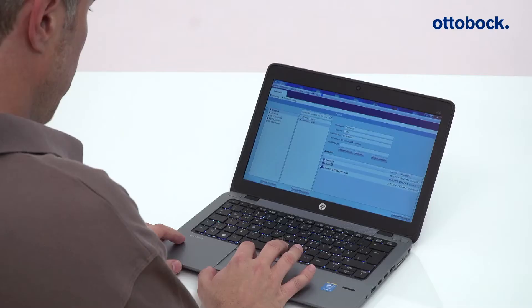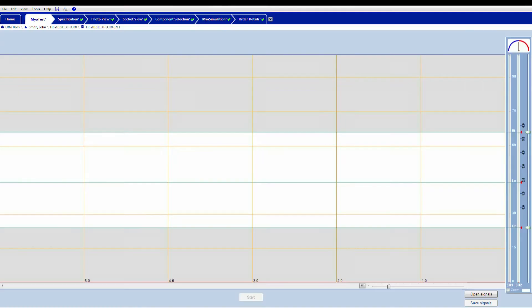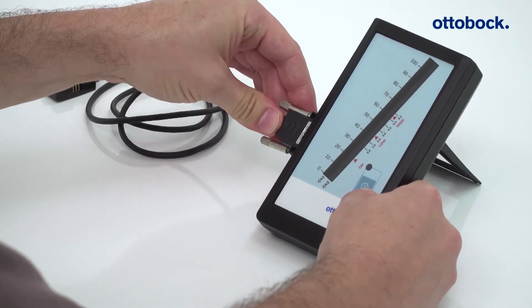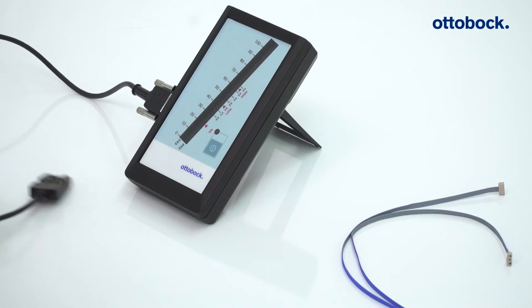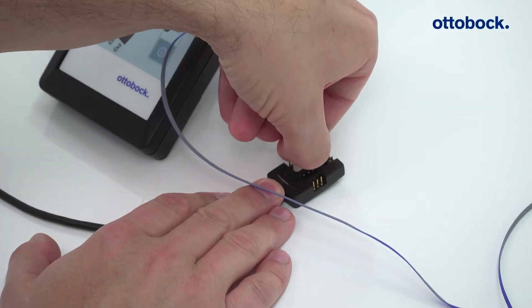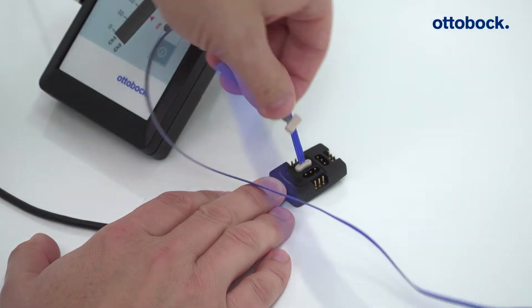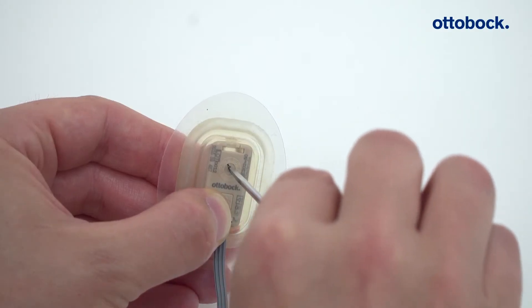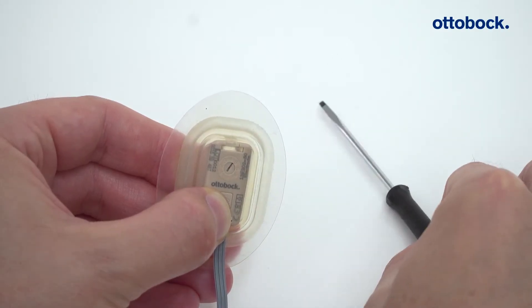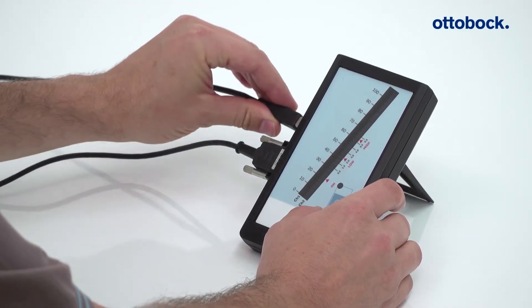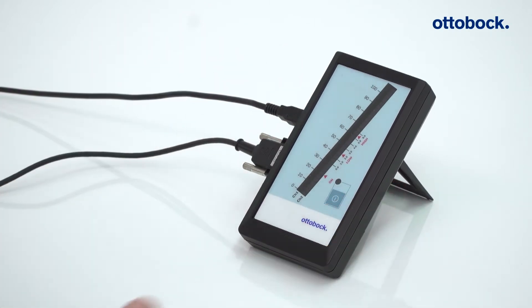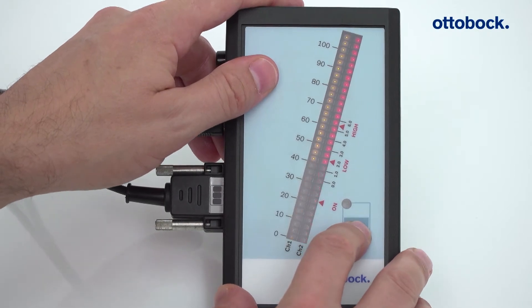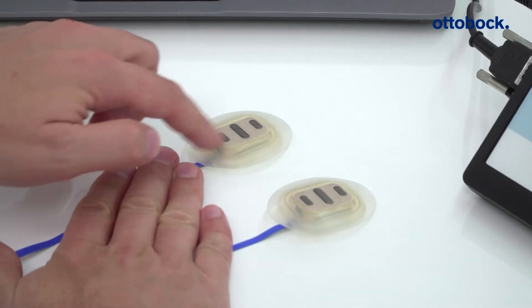Begin by connecting the components. Start Paula software. Connect the myoboy to the electrode adapter. Next, connect both electrodes to the connectors in the center of the electrode adapter. Check the gain and set it to 5. Connect the myoboy to the PC using the USB cable. This will enable you to see the electrode signals represented on the screen by the software.